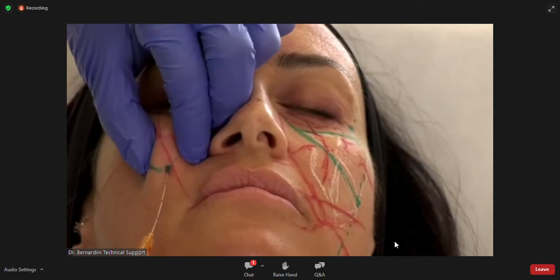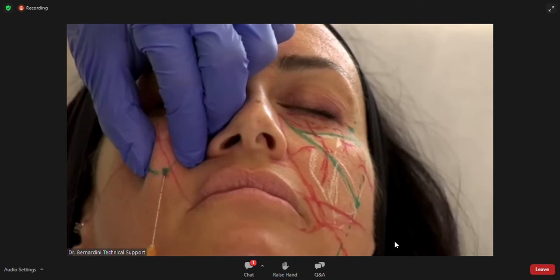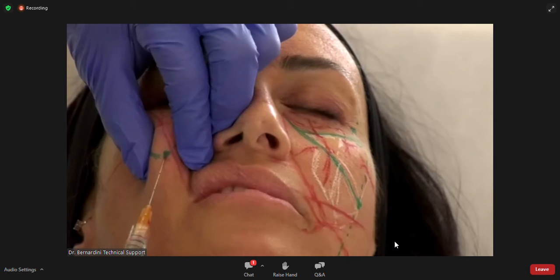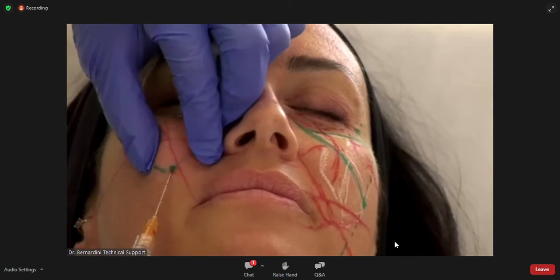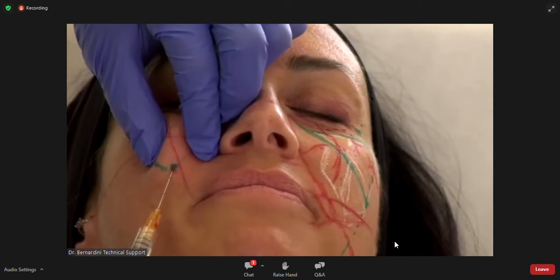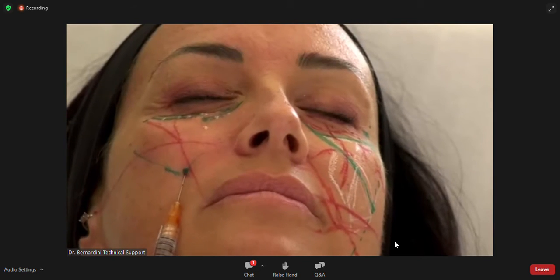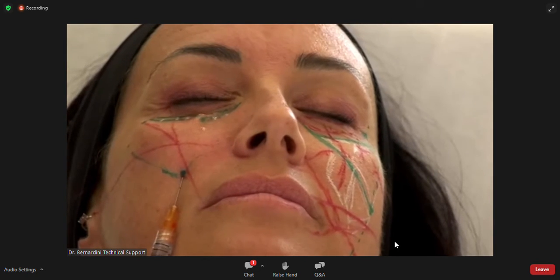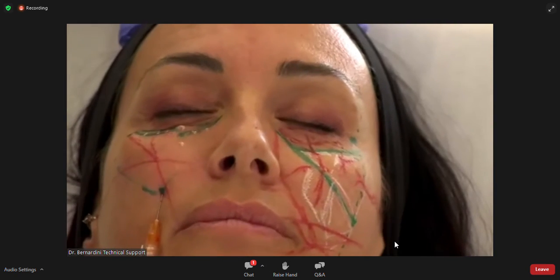Superficial, I slide superficial, so it's less painful or not painful at all. And you see it slides very well. So Serena, is it painful or not? No. So we don't have much pain until now. So I get to the first point of injection here, you see, I'm pushing on it. So Serena, pushing down. Okay, perfect.